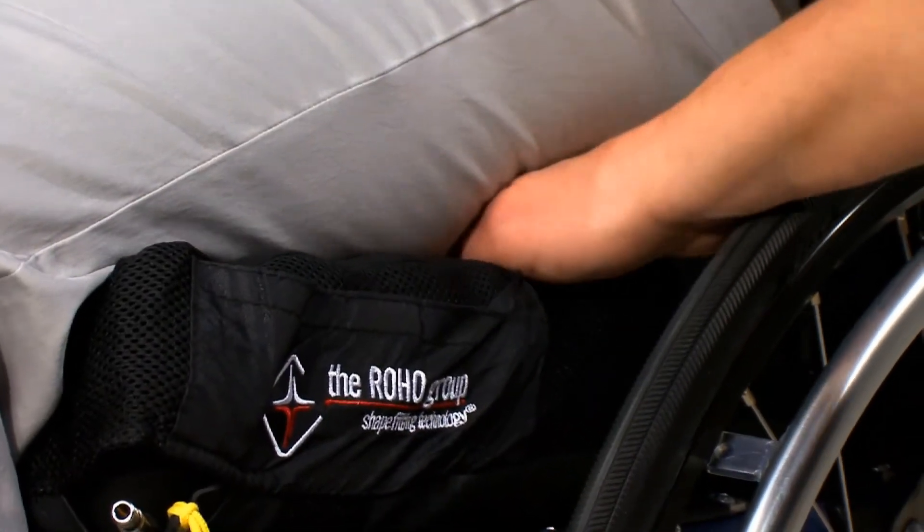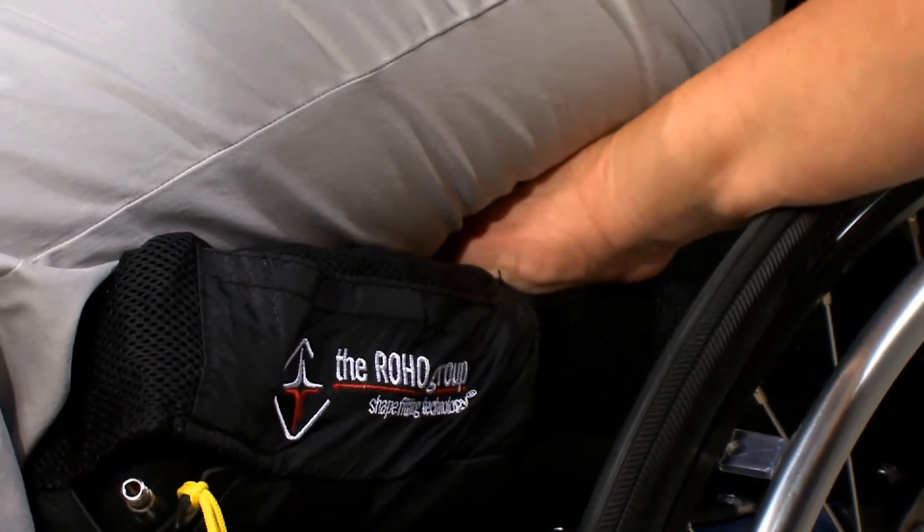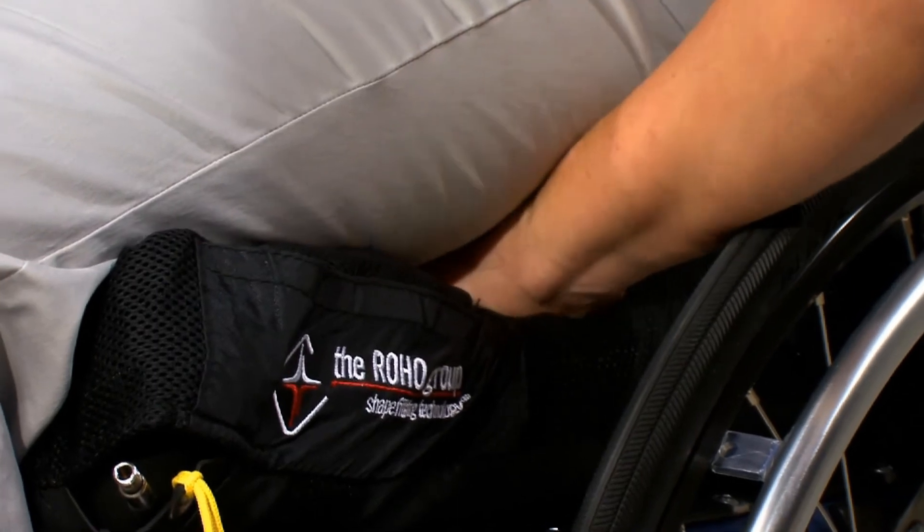Recheck each compartment of the cushion to ensure proper inflation. ROHO recommends doing a hand check daily to ensure the cushion is properly inflated. If the suggested distance has changed and there is more or less air in the cushion, make adjustments as just demonstrated.